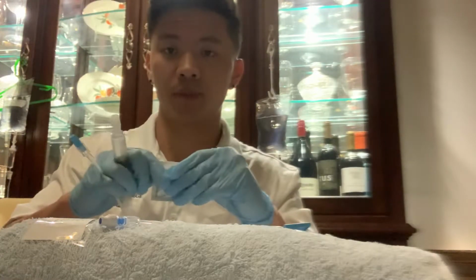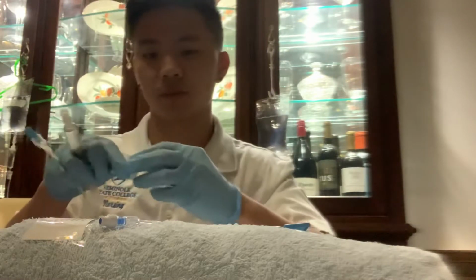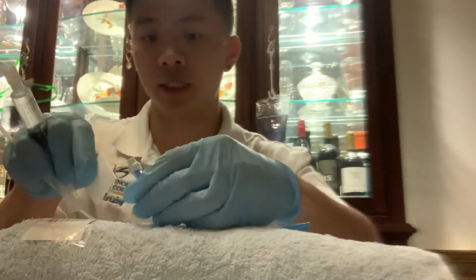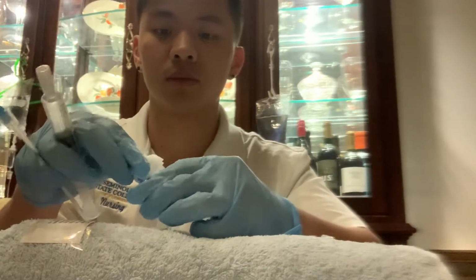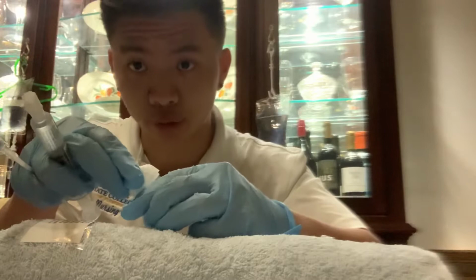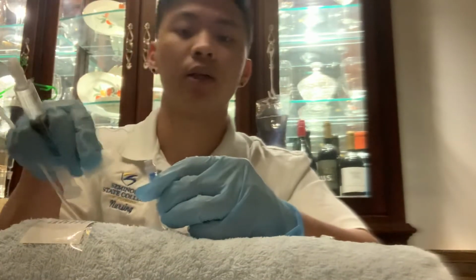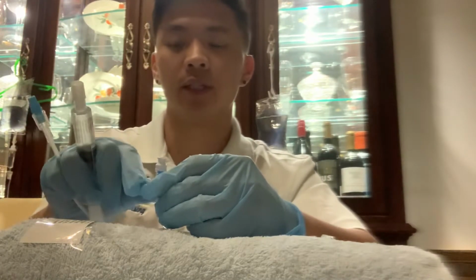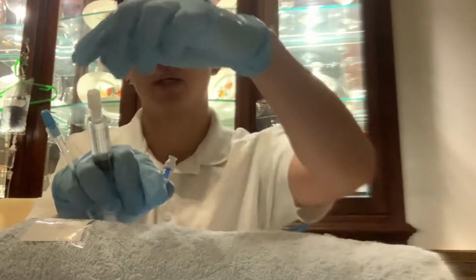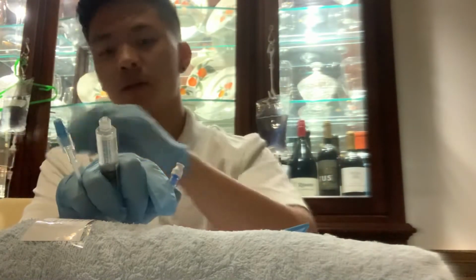I'm gonna first start by opening up the alcohol pad. I'm gonna go ahead and clean the injection port of the saline lock. I would clean it for 30 seconds. After 30 seconds has passed by, I'll allow it to air dry. After it's done air drying, I would go ahead and take the cap off the saline.